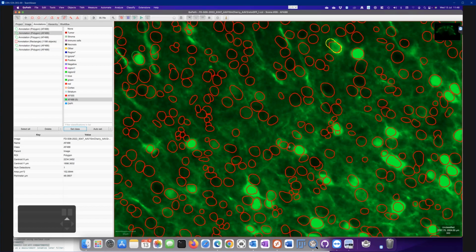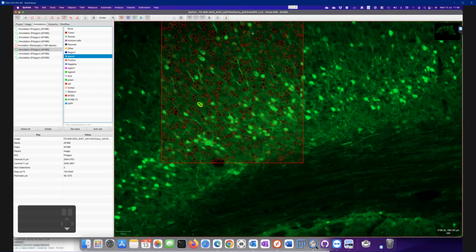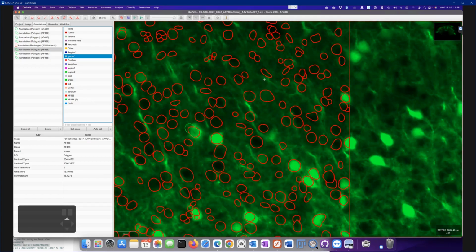It's quite useful to have various situations as well, because we are training an algorithm to identify those cells. And now I want to use the ignore class here to set up examples of cells that are not considered as green.